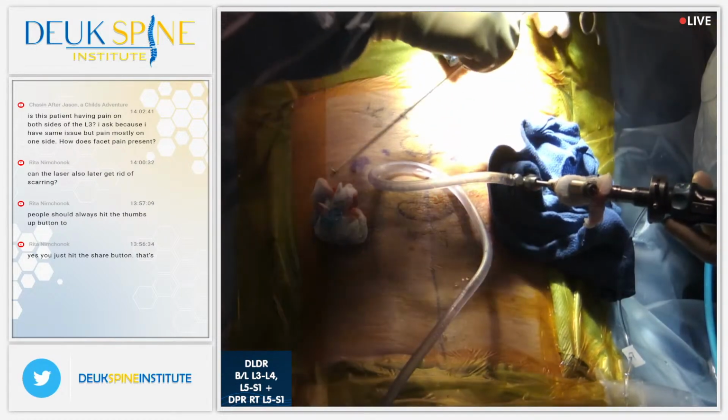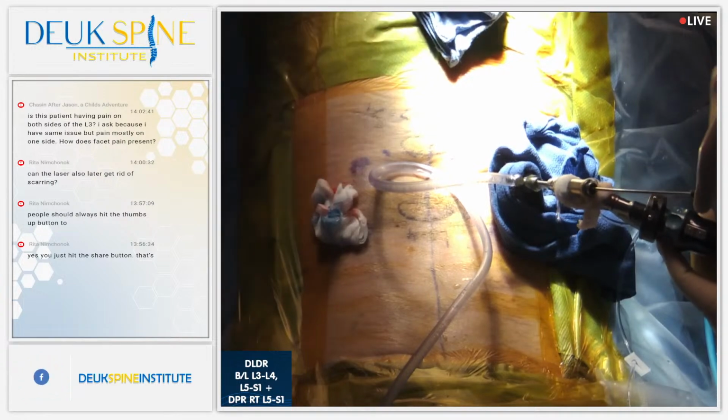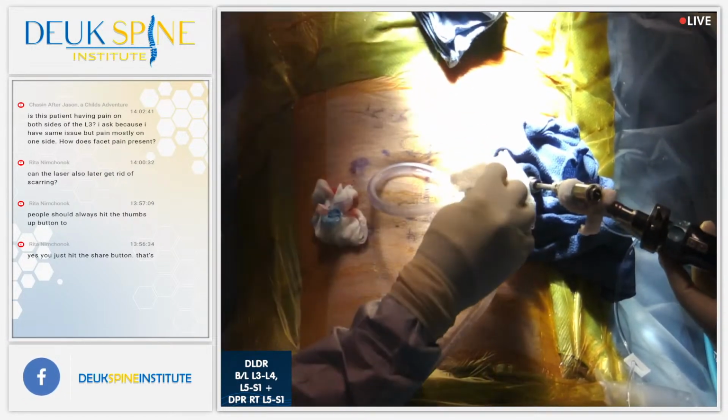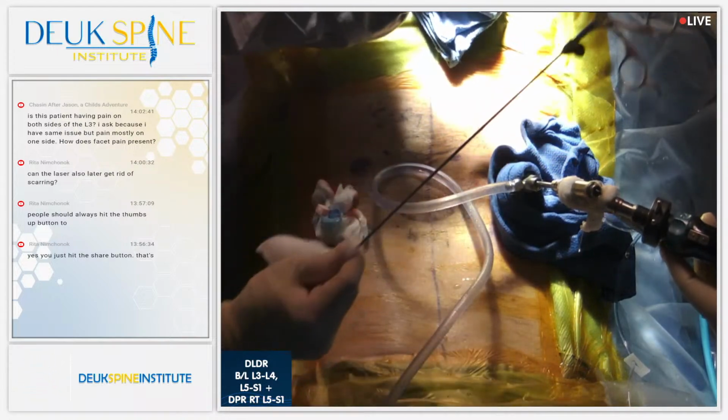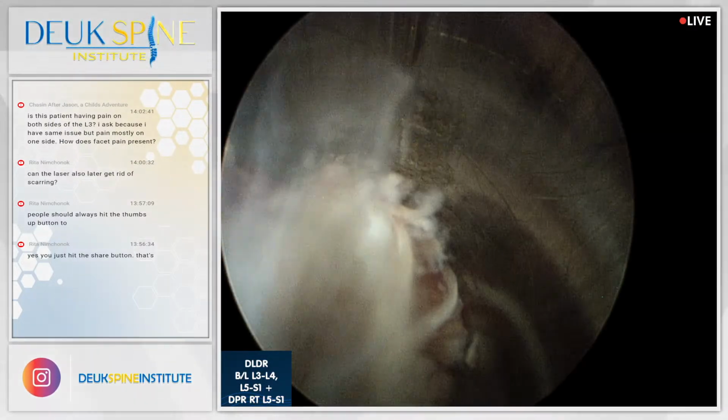Yes, we have a couple of questions. This next one coming from Rita once more on YouTube, asking, can the laser also get rid of scarring? Yes, the laser can get rid of scar tissue. We do it all the time during our surgery.